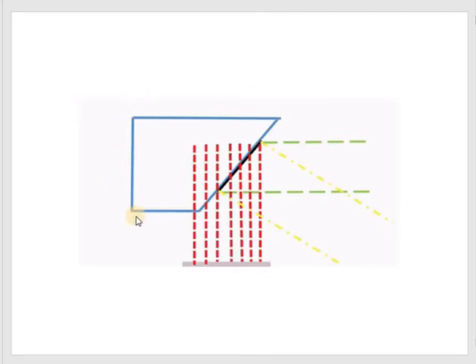So just imagine if this anode target is designed at a reduced angle. You would notice that the focal spot size will be significantly reduced and will further reduce the effective focal spot size. Thus, this is the reason why focal spot size or effective focal spot size is highly dependent on the anode target.